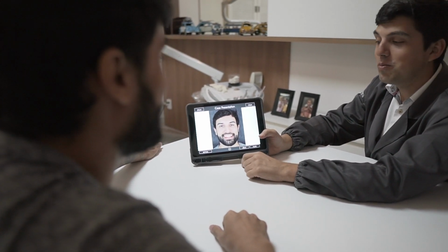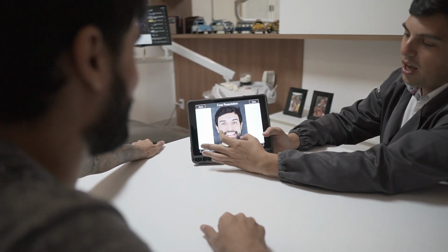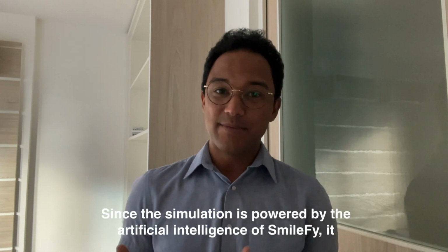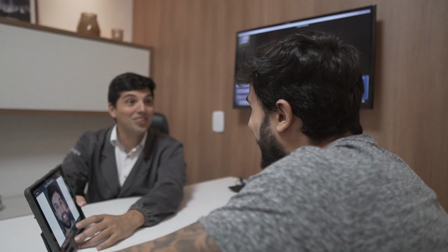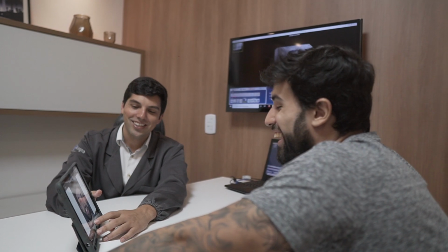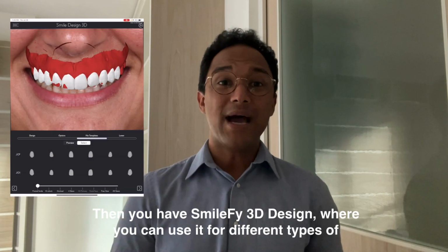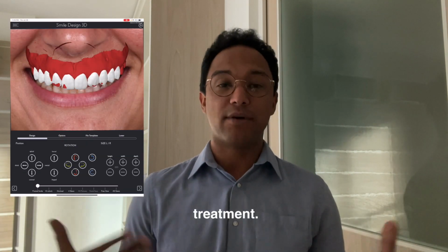the easiest way to communicate and educate your patient. The process is straightforward. You will take a smiling picture of your patient and start the smile simulation. Since the simulation is powered by the artificial intelligence of SmileFy, it doesn't take more than 1 minute to be ready, and the best thing is that you can do it chairside together with your patient and simulate different treatment options. Then, you have the SmileFy 3D design, where you can use it for different types of treatments.